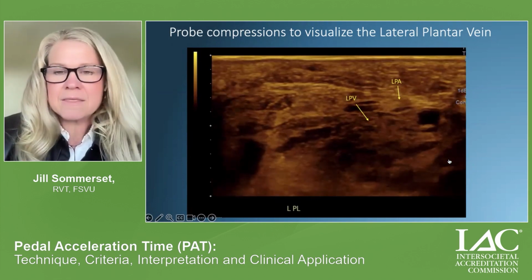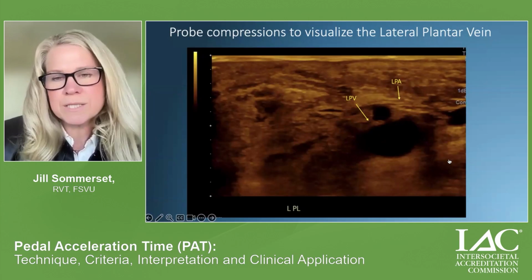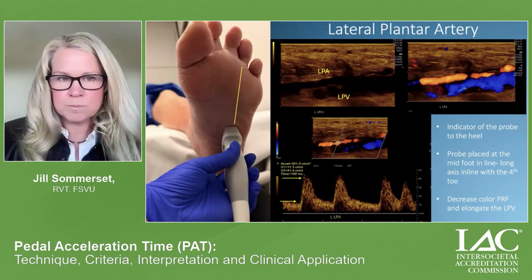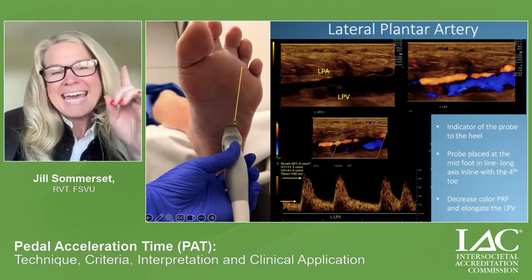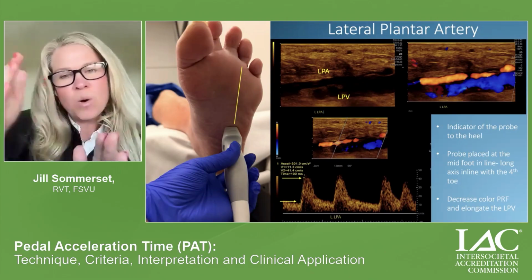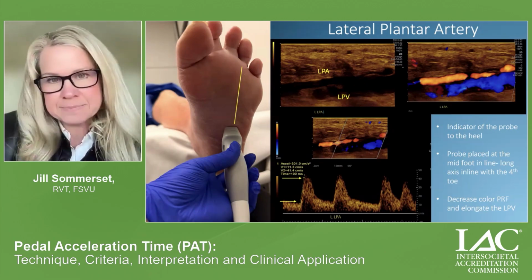And luckily, the pedal venous anatomy is pretty generous in these patients. So once you see the lateral plantar vein, just focus on that. And then you're going to elongate your probe. Again, probe in line with the fourth toe and indicator towards the heel. And the reason is it's going to feel weird to scan, but you want your toes to always be on the right-hand side of the screen.